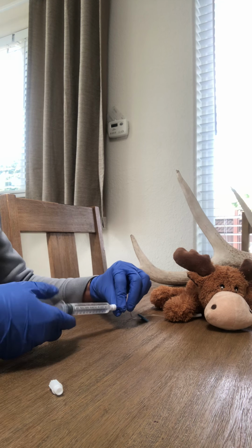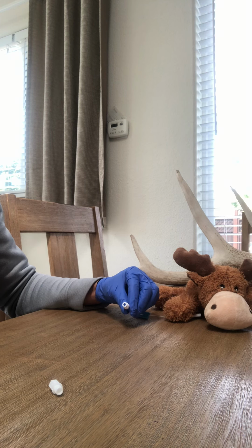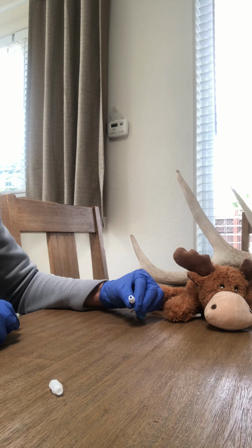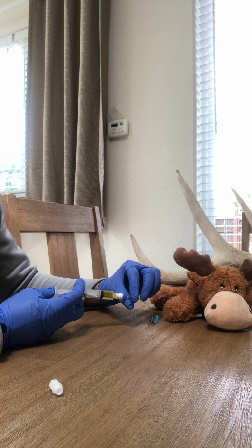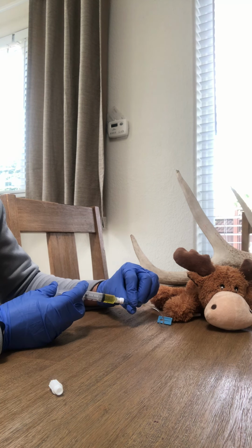And then once I flush it, I'm going to remove that, and I'm going to cleanse this again with a new alcohol swab. Let it dry. Attach my medication. I'm not actually going to push it because it's going to get all over my table, but I would be pushing the medication at the prescribed rate.